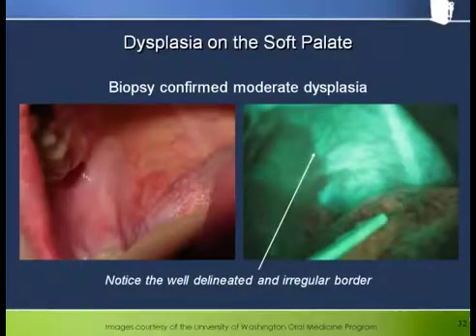Even without the fluorescence image, the presentation under white light has all the earmarks of trouble: a white patch, well-delineated borders, etc. Hopefully most clinicians would not ignore this. It is nevertheless instructive to compare the fluorescence presentation with that under white light.